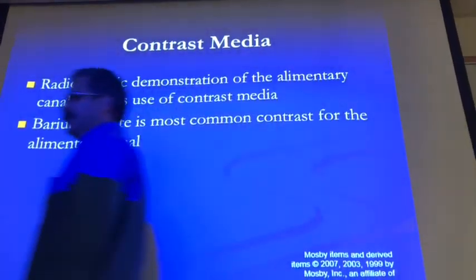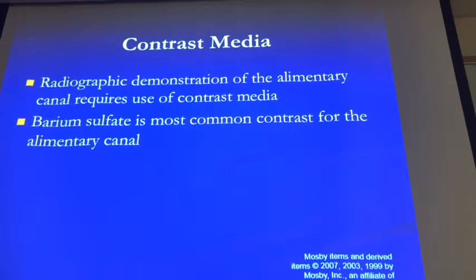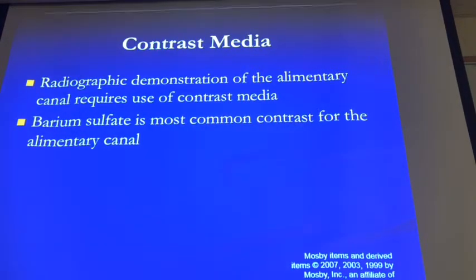Why barium? Okay, barium is very stable. When I say stable, it means that it doesn't change into other things. Sometimes elements can change, but barium is very stable. It won't change. And it's not absorbed by your body. So you take it in and it goes out. Your body's not going to be absorbing anything. So in that sense, it's ideal.